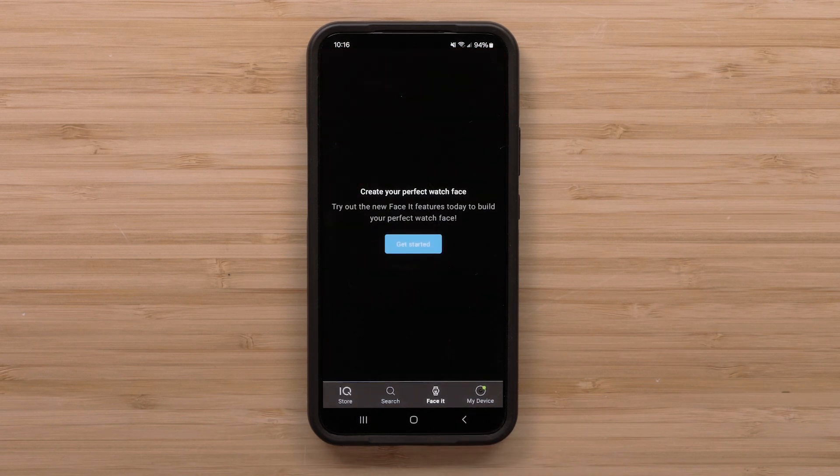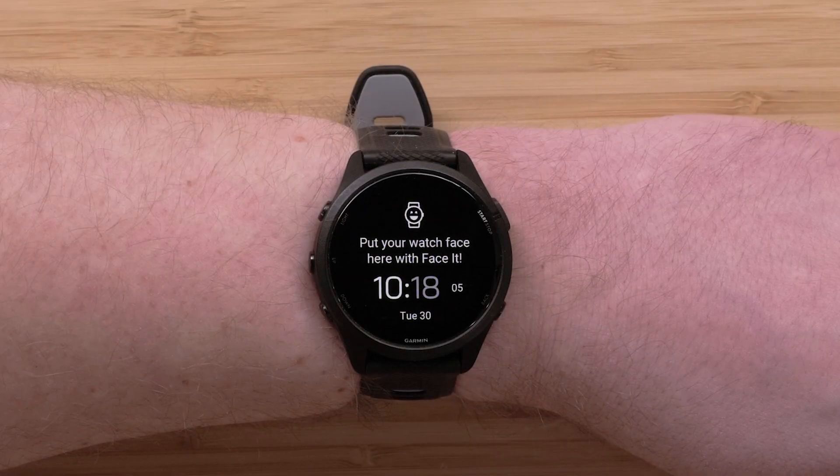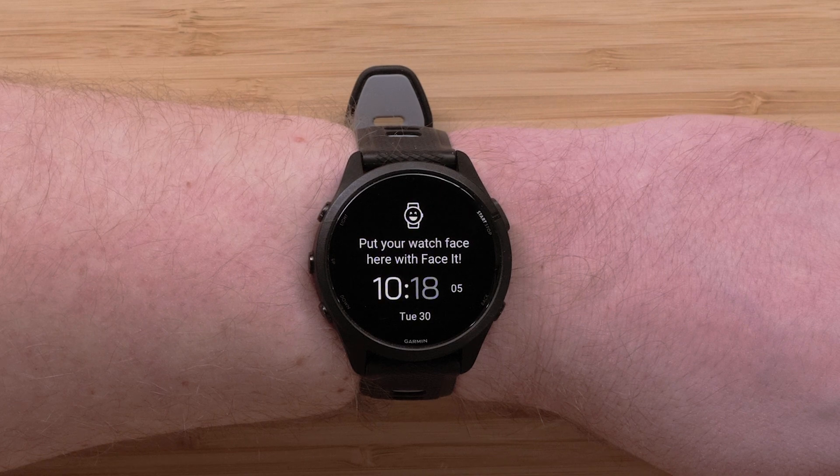If this is the first time you have used FaceIt for this watch, you will see Get Started. Select Get Started. The default FaceIt watch face will be sent to your watch and will stay on your watch as you create your custom watch face in the Connect IQ Store app.